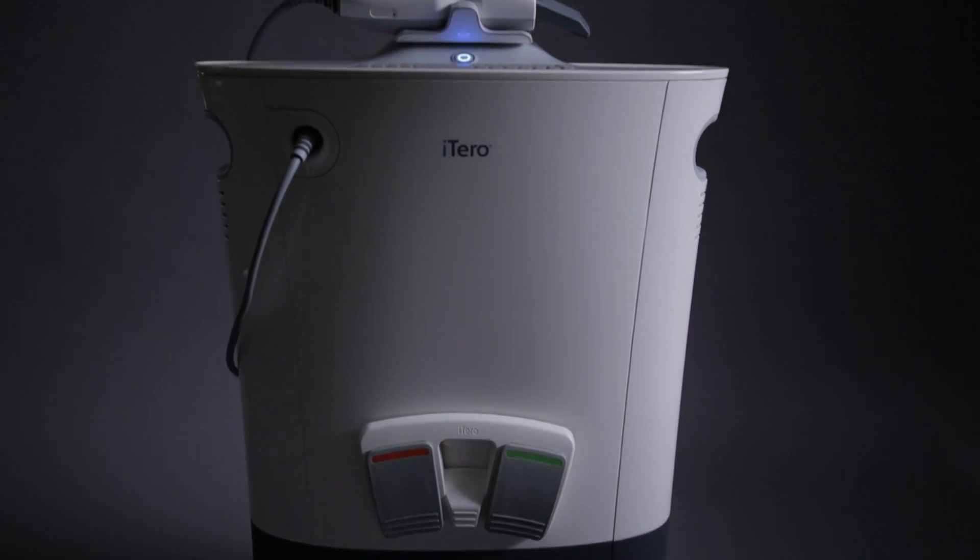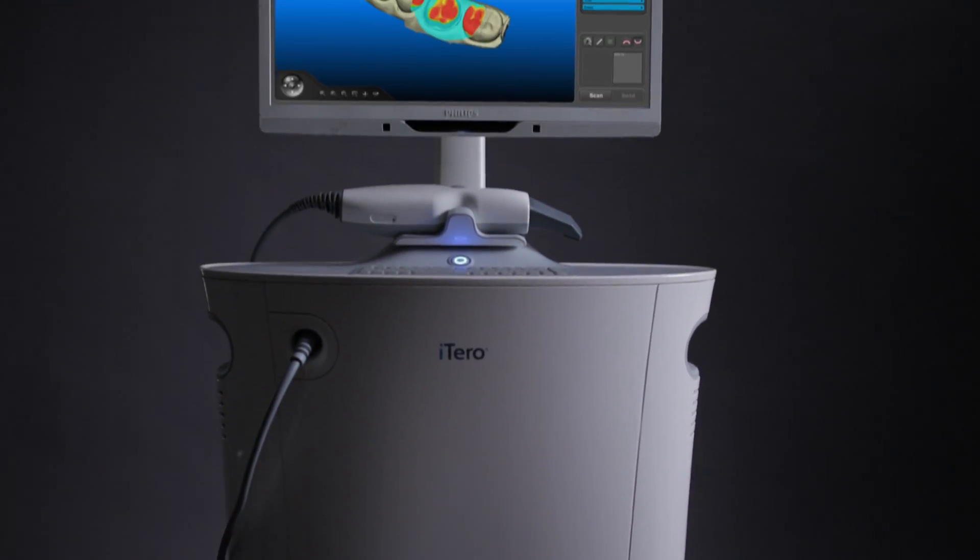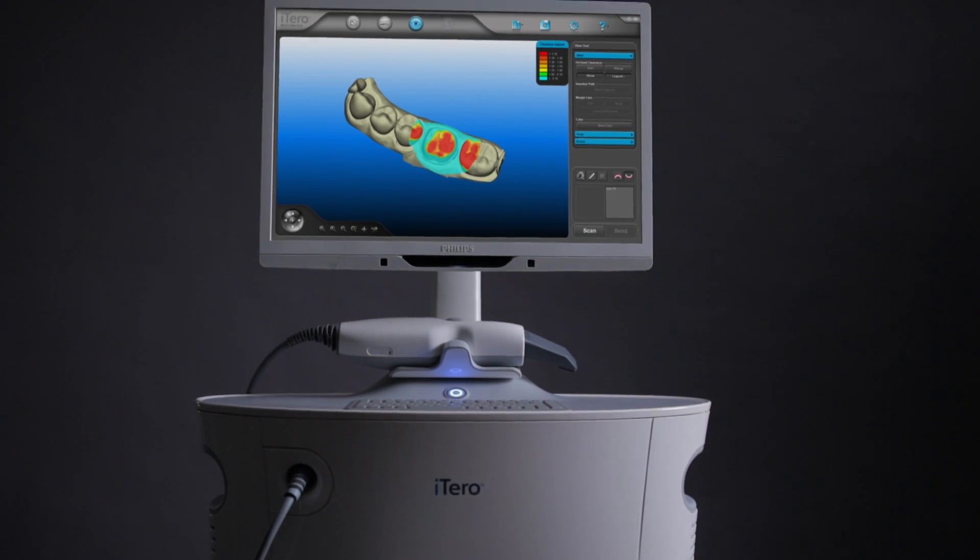My name is Brett Jacobson. I'm a dentist in Federal Way, Washington. I'll be showing you a crown prep and scan using the iTero digital scanner, as well as a crown seat on a case that we used the iTero scanner to fabricate the models to make the restoration.